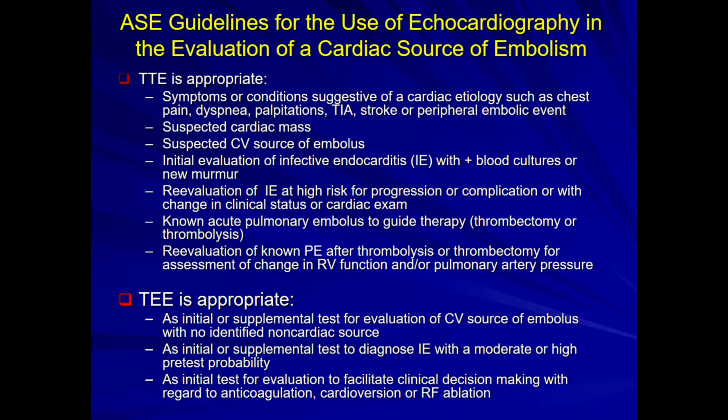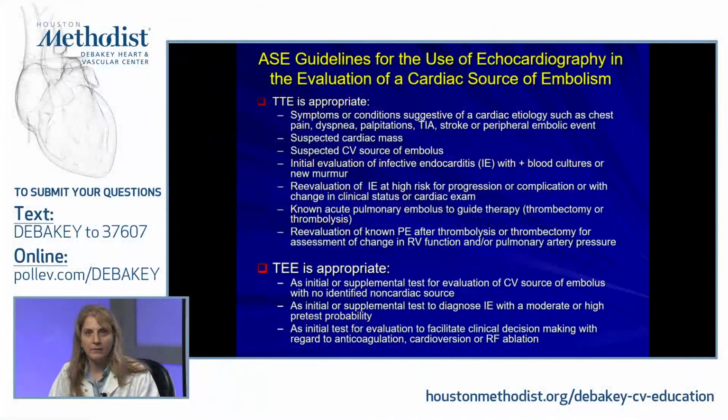So if you look at the ASE guidelines for the use of echocardiography in the evaluation of a cardiac source of embolus, you can see this is the appropriate criteria. And literally, we're running out of time, and I want to save enough time for Carlos. But literally what it says is it's pretty much appropriate in every single patient. So yes, we do a lot of TEEs for patients following stroke looking for cardiac source of embolus, and this is why.